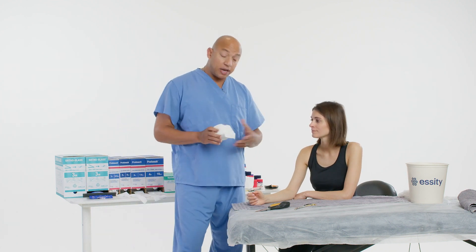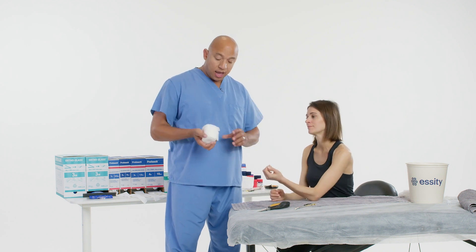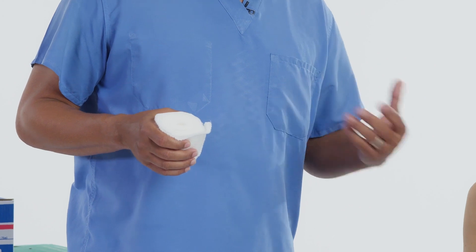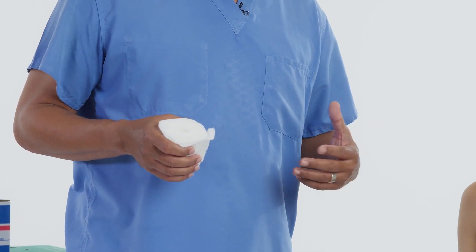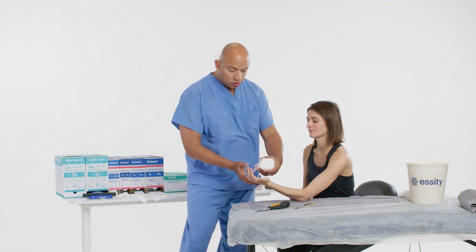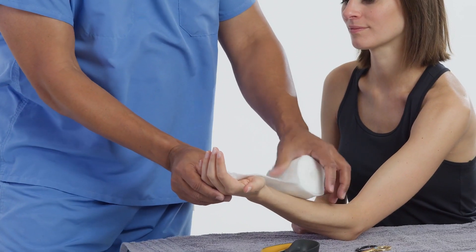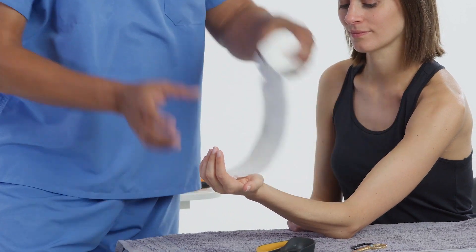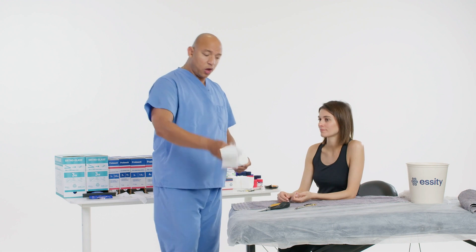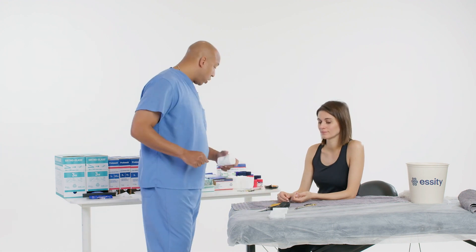First, I'm going to measure on the uninjured extremity and ensure that there's no jewelry on the patient. Also check for any skin issues, abrasions, and so on, just to ensure everything is good to go prior to application. You can have the patient on the non-injured extremity, just use some padding or a measuring tape — that's a little bit quicker. And there's our little template that we're going to be using.